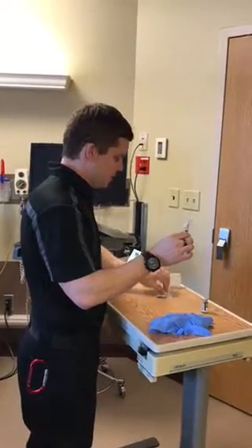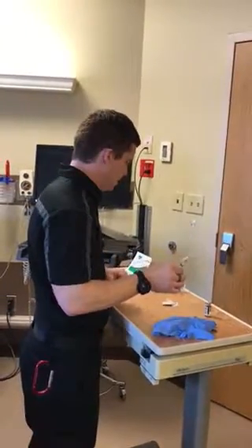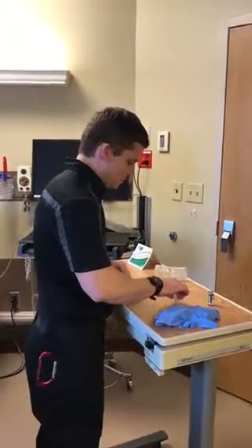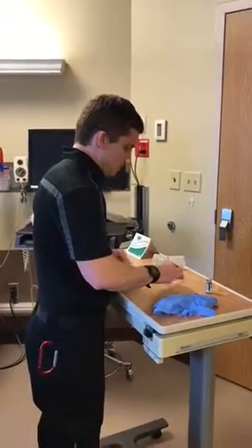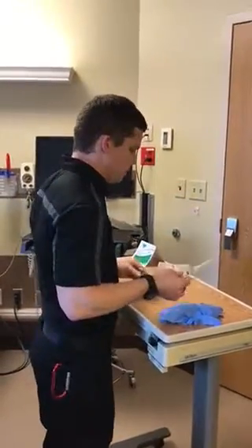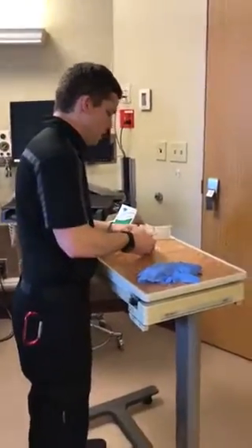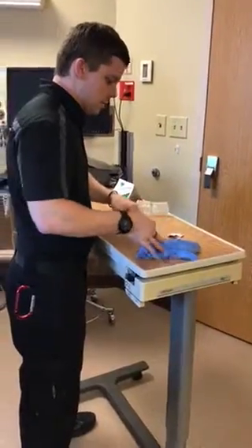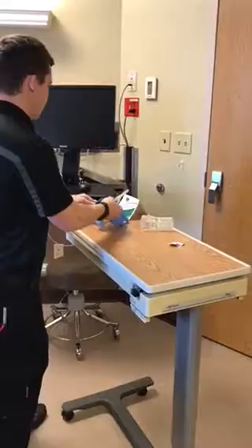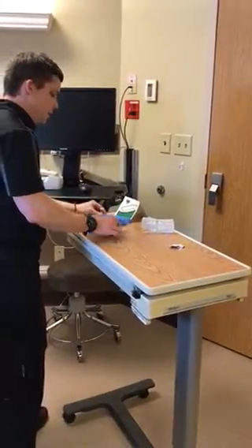I would have set my cap on a clean surface, though I didn't this time, so I'd probably end up getting a different cap. But for now, secure the needle. All right, now we're going to go into the patient's room, so I'm going to bring all of my equipment, the vial, and the medication in with me, and set it off at the patient's bedside.